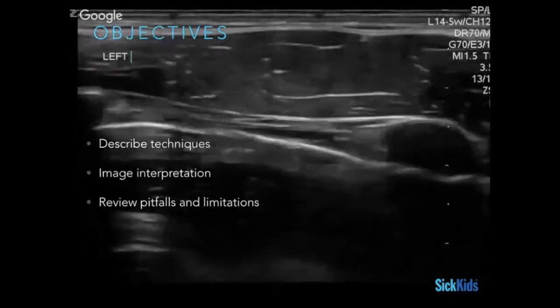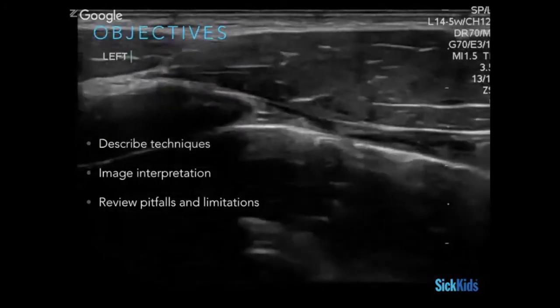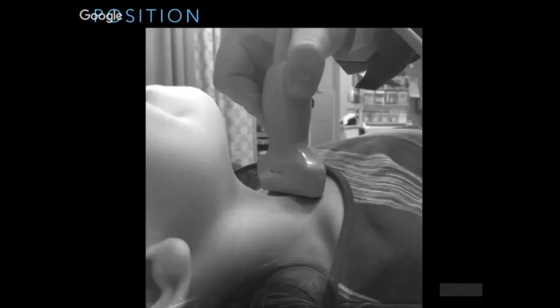So there's two parts to this, airway and lung. So we're going to start with airway. This picture is worth 1,000 words in terms of where do you go. So we're going to talk about what transducer do you use and what locations you want to be in.